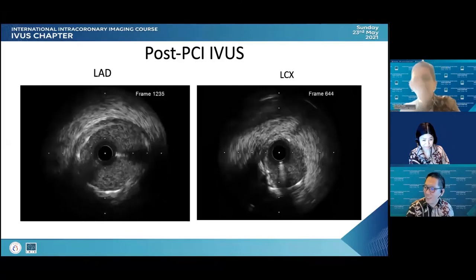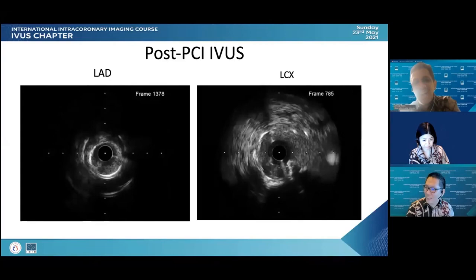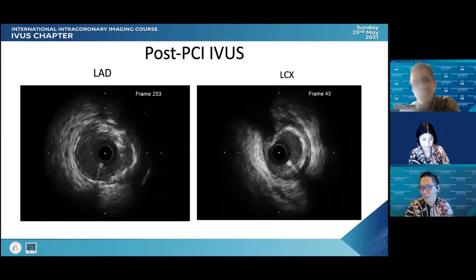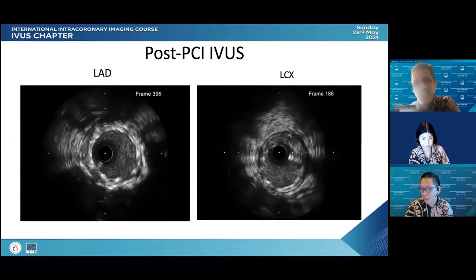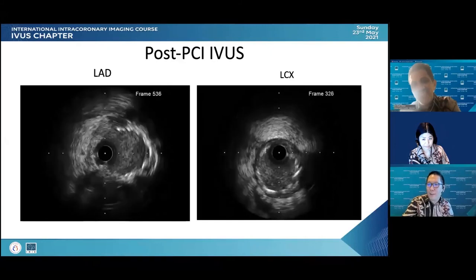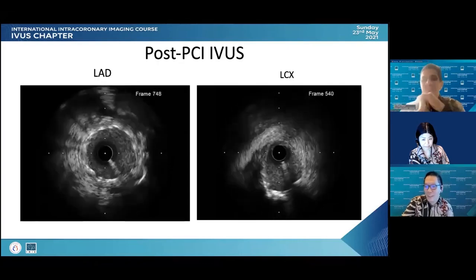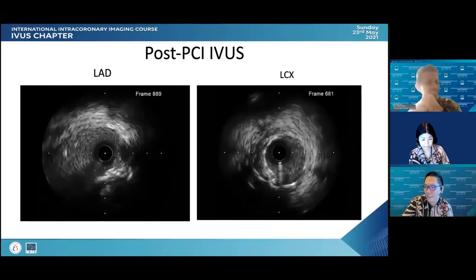The quiz, this kind of quiz of how the IVUS reveals the circumflex. I know it looks like you got it. Yeah, so it has some malposition at the ostium of the circumflex, but I think it's almost never perfect at the bifurcation to stent like this all the time. If you try to correct everything like this, maybe 4 or 5 hours for one case like this.